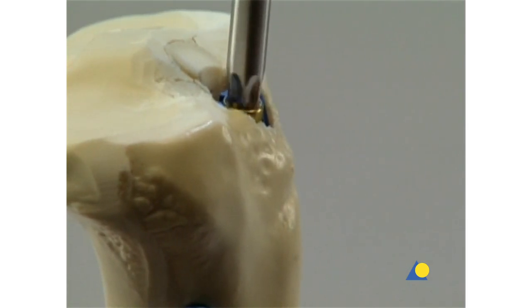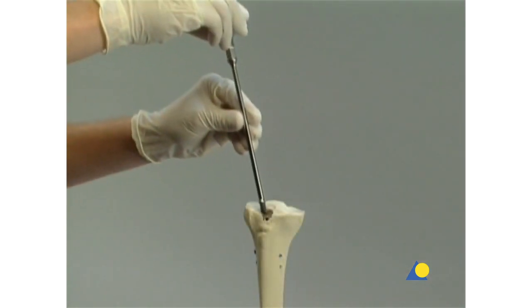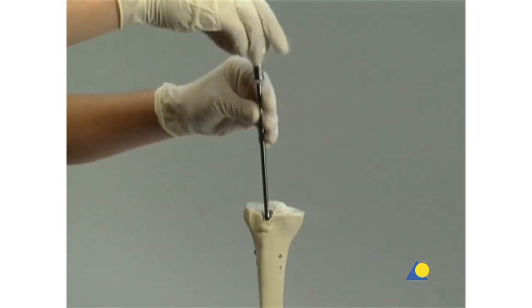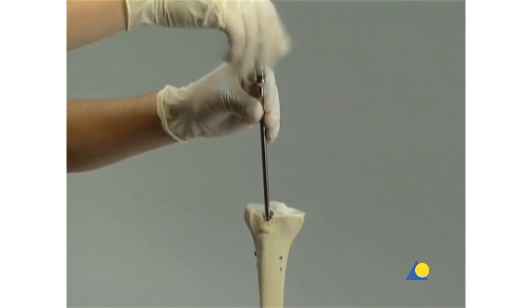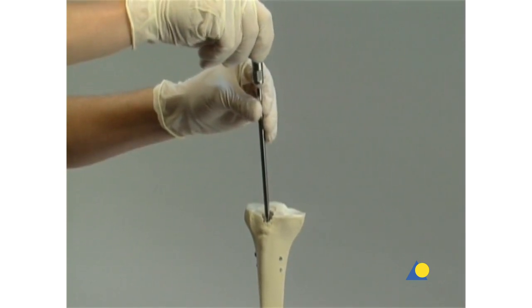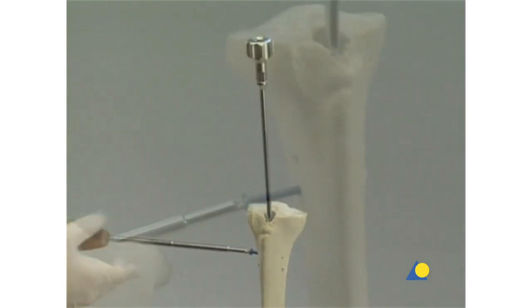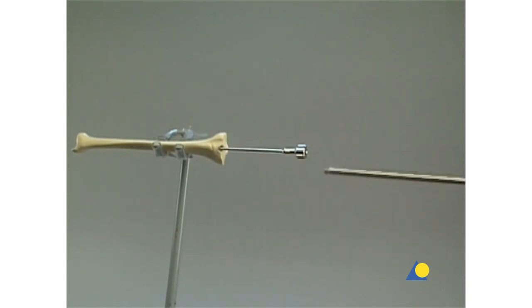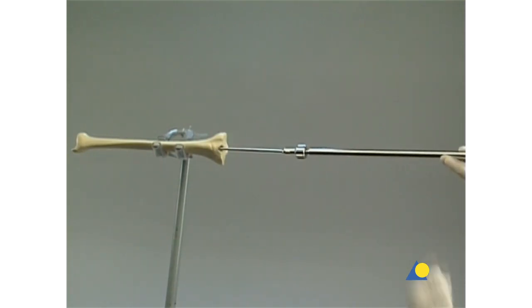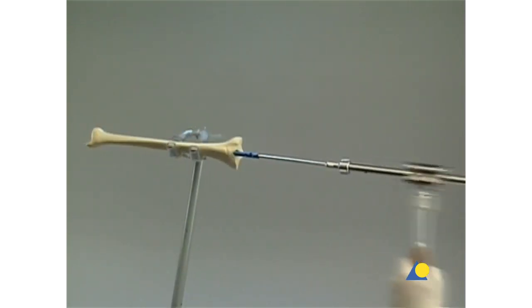Implant removal begins with the end cap using the star drive screwdriver. The extraction screw is introduced into the nail and tightened. The proximal locking screw is used to prevent rotation or displacement of the nail posteriorly below the tibial plateau. All locking screws are removed with the star drive screwdriver and holding sleeve. The hammer guide is attached to the extraction screw, and the nail is removed with gentle hammer blows.